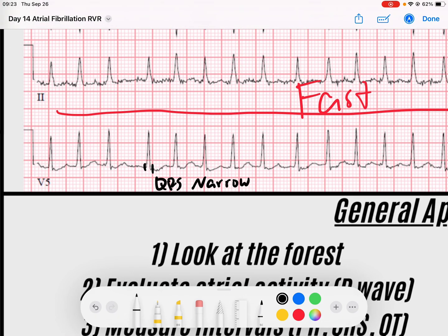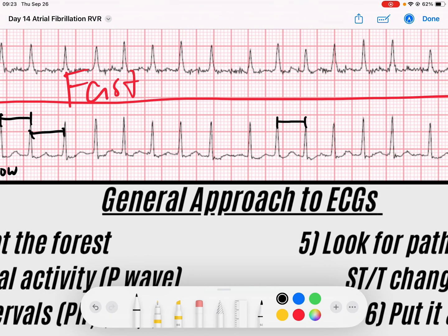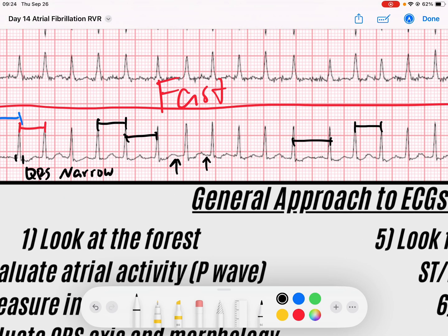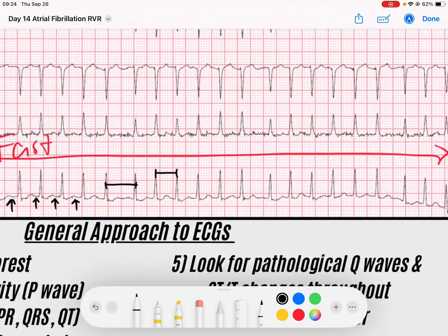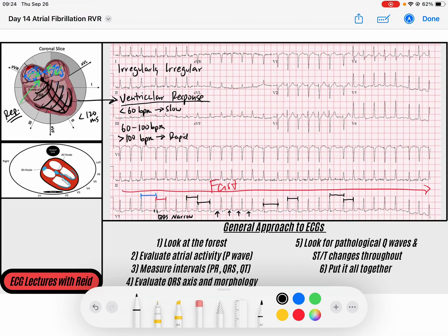So we have a narrow complex QRS, which tells me the QRS is being generated from a supraventricular origin. I look at the rate and notice some variation: some R-to-R intervals are a little longer than the next. Looking in front of all my QRS complexes for any identifiable coordinated atrial activity — a nice coordinated P wave — I don't see any. This irregular rhythm with longer and shorter R-to-R intervals, no identifiable P wave activity, and a narrow complex tells me this irregularly irregular rhythm is being generated within the atria itself, with the AV node conducting it in a random fashion. This is atrial fibrillation.